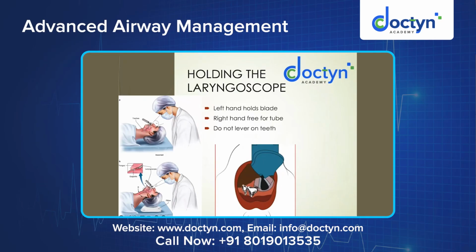So for intubation, we need visualization of the vocal cords. How do you visualize the vocal cords? Usually when you open the mouth, you will only be able to see the tongue, and at most the hard palate, right? So when the tongue is swept away from your view, moved to one side, you will be able to see behind the tongue. So what is there behind the tongue?